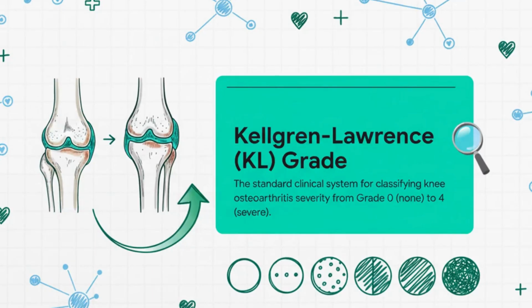And all that analysis leads to this, a standardized clinical score called the Kellgren Lawrence grade, or KL grade for short. This is the absolute gold standard in the field for classifying how severe the arthritis is. It's a scale from grade 0, which means no signs at all, the way up to a severe grade 4. It gives a clear, simple result that any doctor can look at and know exactly what to do next.